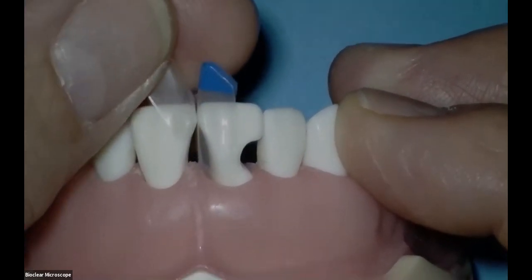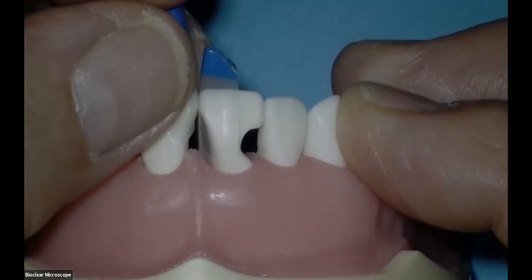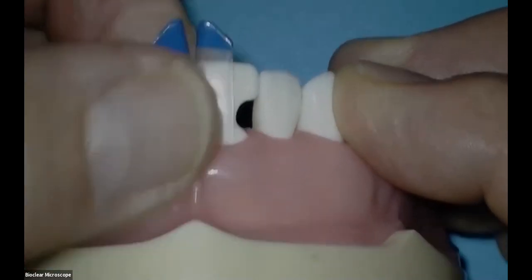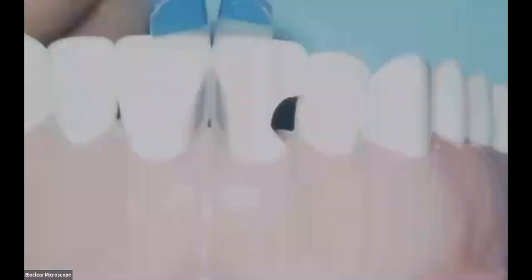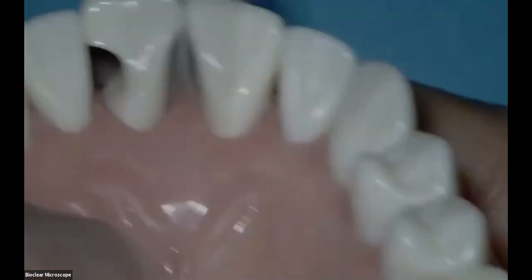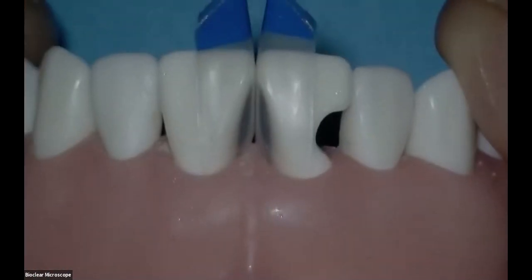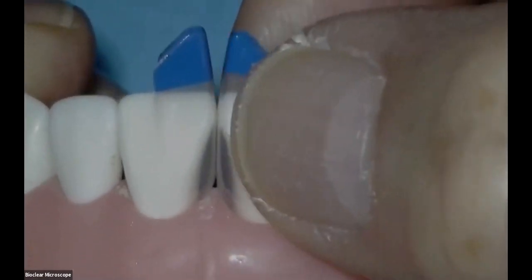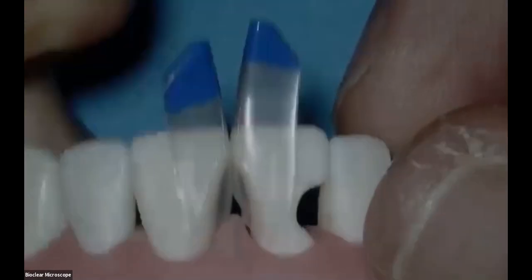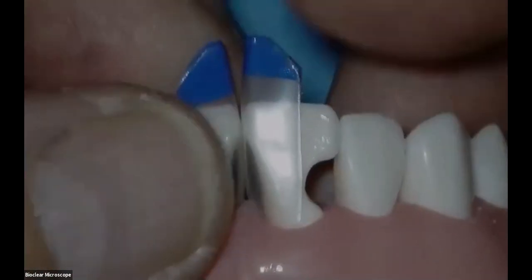So if the matrix doesn't go in place, I have to remove the matrices and do some sanding. You'll notice that we have a nice closure of the black triangle. This is the new HD material that is as strong as stainless steel. Now you do need to grip the matrix with your hands. You can't just push on it like this because it'll bend. So you have to grip it against the tooth and seat it all the way down.